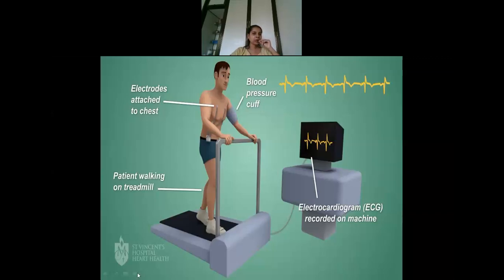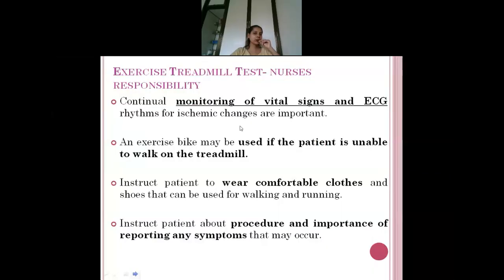Now next is moving on to the nurse's responsibility. What all they have to do. I'll tell you the exact procedure also in the coming slides. So before that we will see what the nurse's responsibility is.